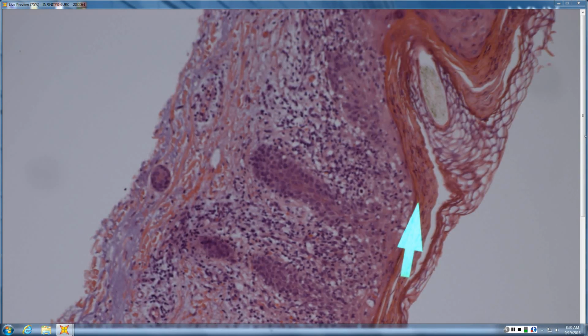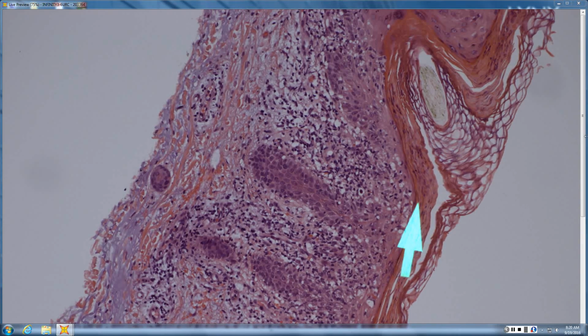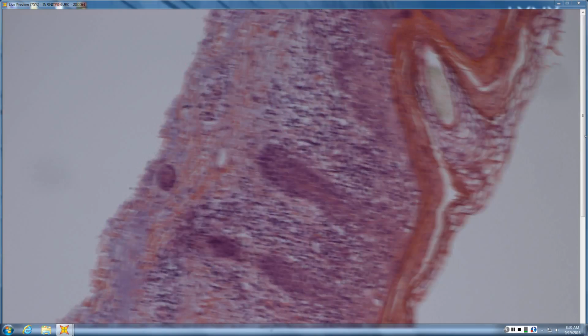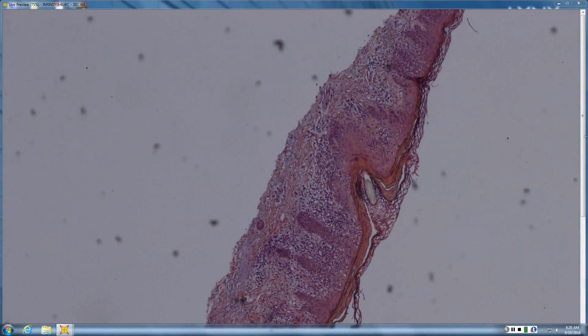Also keep syphilis in your differential, because syphilis will have a scale crust, syphilis has elongation of the rete, syphilis can have an interface dermatitis, usually not the red cell extravasation. So the red cell extravasation here is a pretty good hint. The red cell extravasation, pretty good hint for PLEVA, but that would be my differential here, pityriasis lichenoides versus syphilis. You've got a scale crust, you've got elongation of the rete, you have a lymph in every hole interface pattern, you have red cell extravasation.